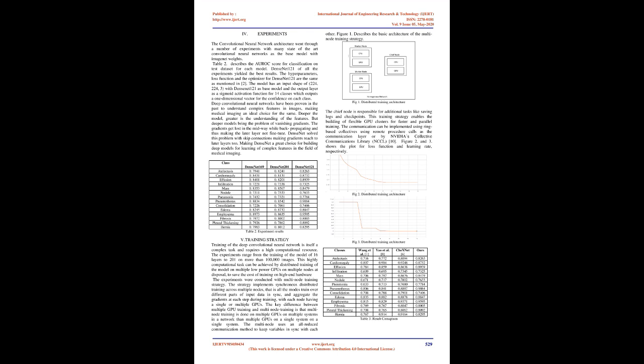3. Dataset. The dataset used is a widely known, publicly available dataset of more than 100,000 high-resolution frontal chest X-ray images by NIH Clinical Center. The dataset is gathered from the scans of more than 30,000 anonymous patients. The dataset is labeled for 14 different thoracic pathologies annotated by professional radiologists. The NIH Chest X-ray 14 dataset has 6 more classes and more images than in recent work 1. The large and varied dataset represents quite a realistic distribution of chest X-rays, which in turn holds a higher chance of yielding realistic diagnostic results.